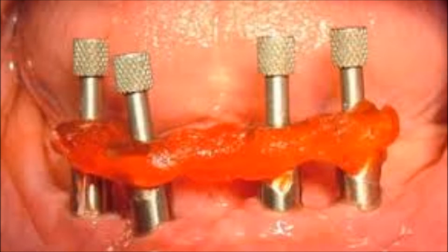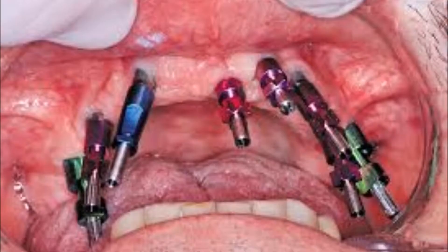Cases with two or more implants usually require resin splinting. These resins often suffer from excessive shrinkage during their setting. Once the impression is removed from the mouth, the shrunken resin displaces the transfers, deforming the impression. On the other hand, unsplinted transfers aren't stable enough in the impression and cannot be relied upon for manufacturing precise models.